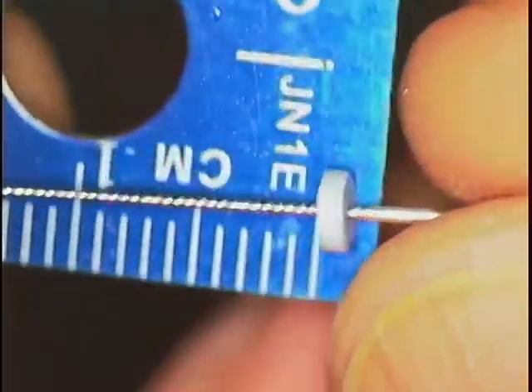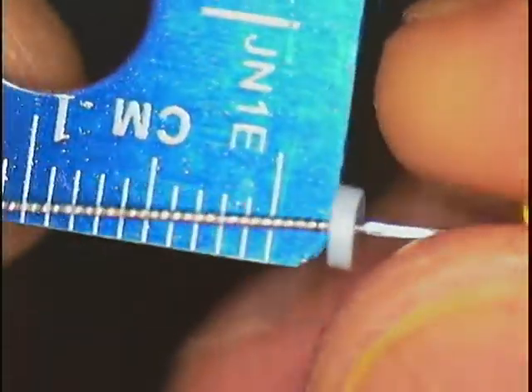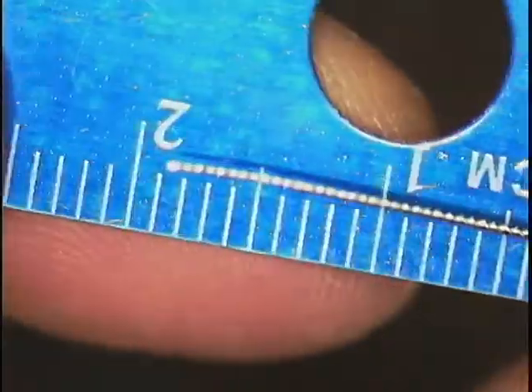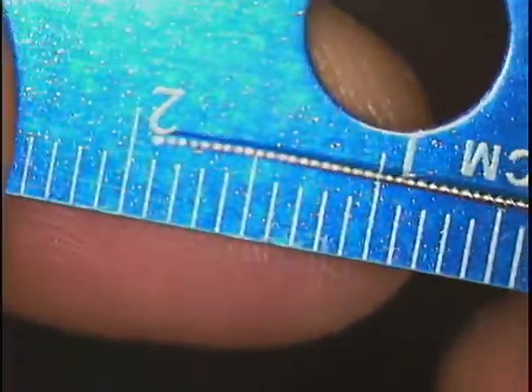Do the same thing, measure it. See how I'm back stepping now? What's the next file after a 20 going to be? Anybody? Number what? Okay, well that's the next one up from it, but what's the next one I'm going to pick up in my hand? A 10, the patency file. You want to always make sure you're patent. As soon as you're blocked, you got to get through the blockage.